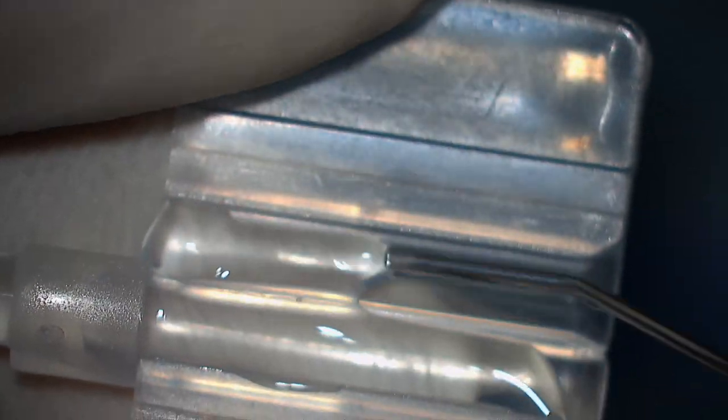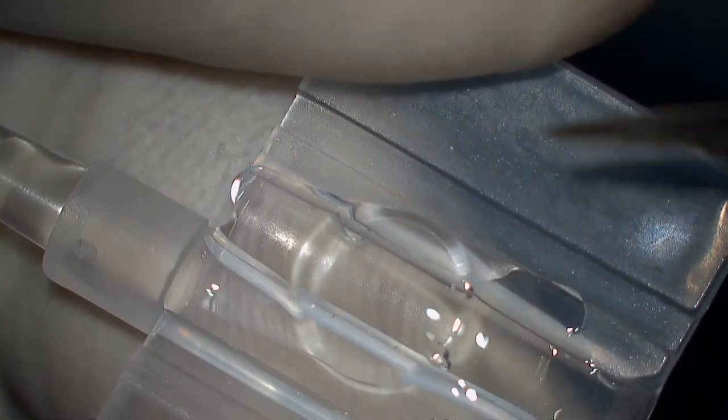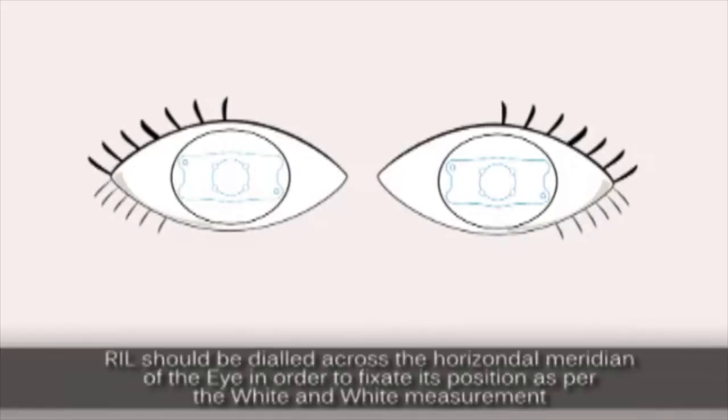Fill the cartridge with sufficient viscoelastic. Make sure that the hole is pointing to the upper right corner. Carefully remove the lens by holding the haptics and place it in the cartridge. Make sure that you see that the dialing hole in the corners are in the top right and bottom left corner.